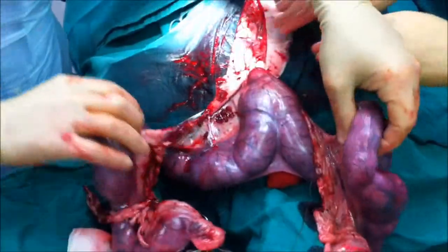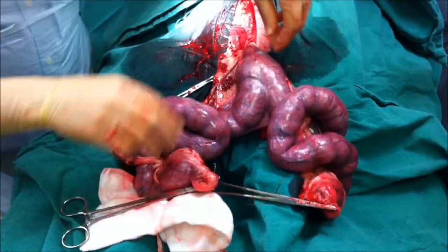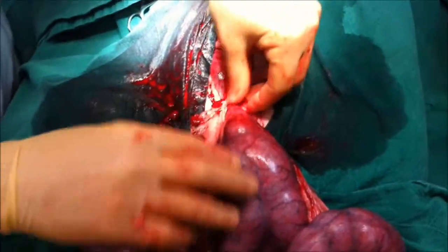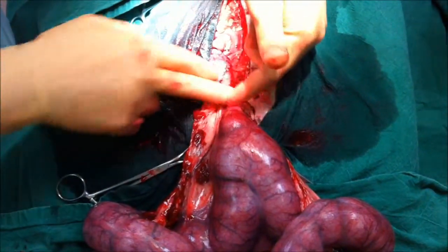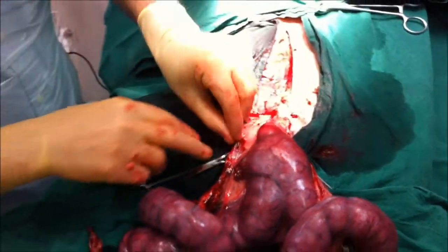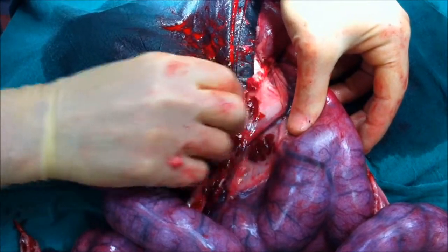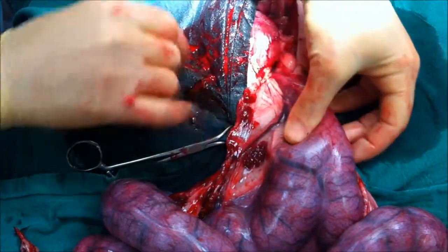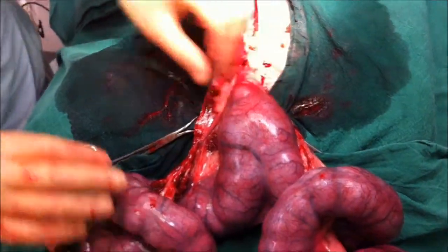We've disconnected the two horns of the uterus and the two ovaries. Now this is where the two come together — this is the cervix, and this goes into the vagina down here. So the last attachment is here that we need to remove. You can see there's some bruising around this tissue just because there's such a big blood supply and very large vessels supplying all this inflamed tissue.